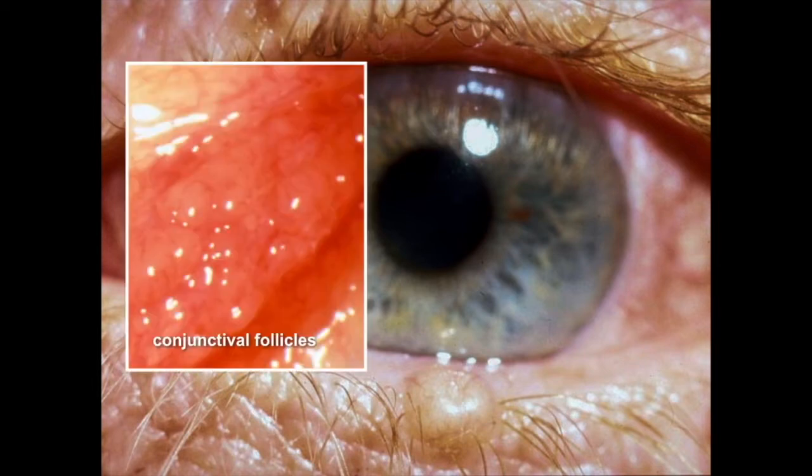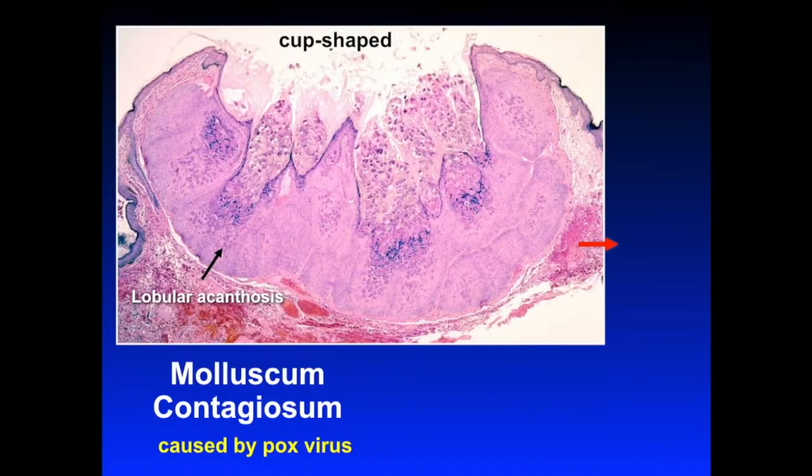Molluscum contagiosum is caused by infection with pox virus. The pox virus can get down into the conjunctiva and stimulate chronic follicular conjunctivitis. Histopathologically, here's a classic crater-shaped lesion. The infection causes lobular acanthosis of the epidermis.